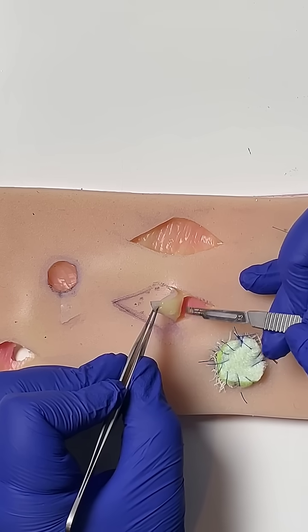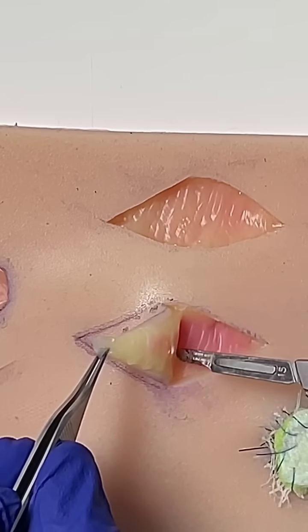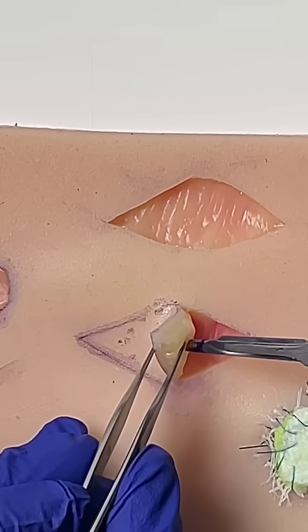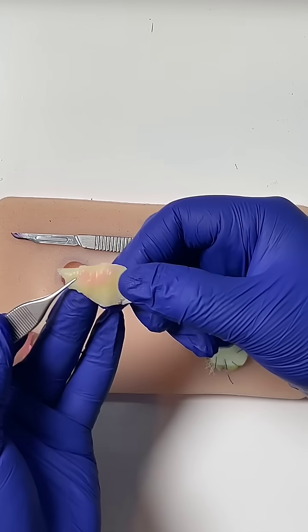If you get a bit of fat, we can trim it later. Sweep from top to bottom — it's really important that you put the traction and the energy into this, so push up and grab it really well. Remember we're not using this — pull up.